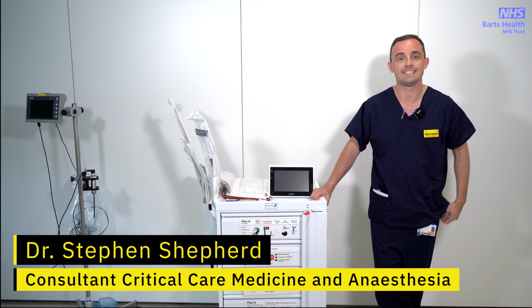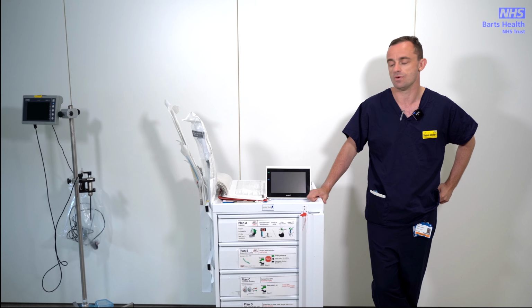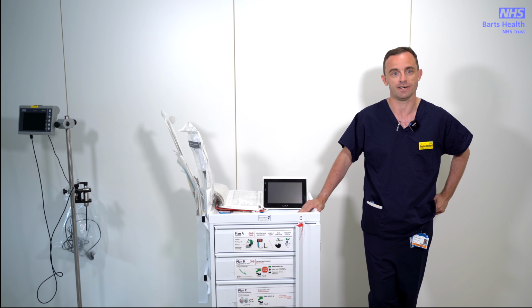I'm one of the consultants in intensive care and anaesthetics here at Barts Hospital, and today I'm going to talk you through the difficult airway trolley and the use of the CMAC video laryngoscope.